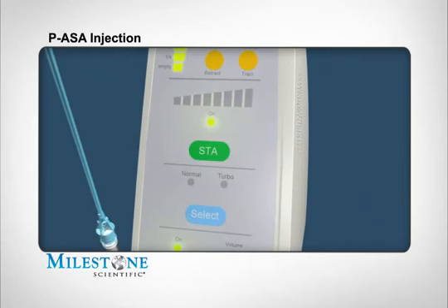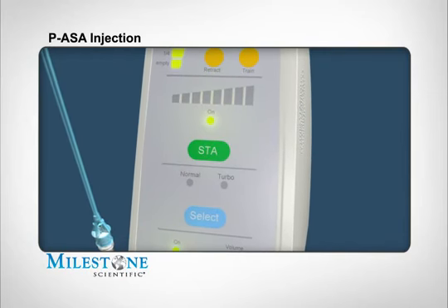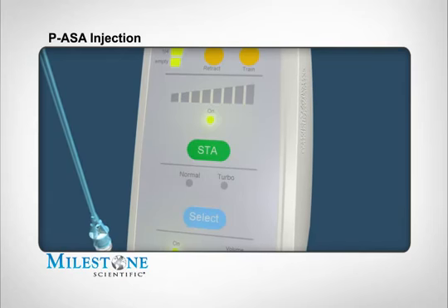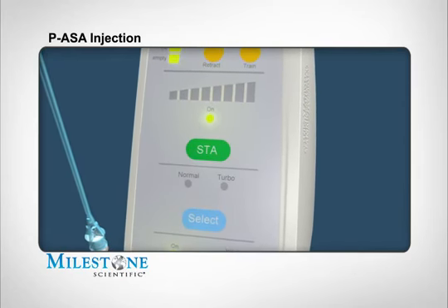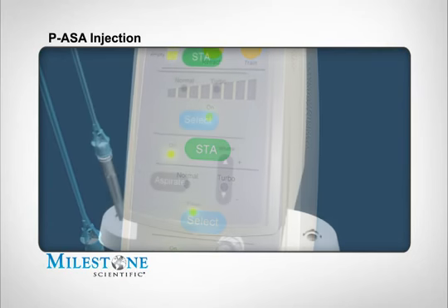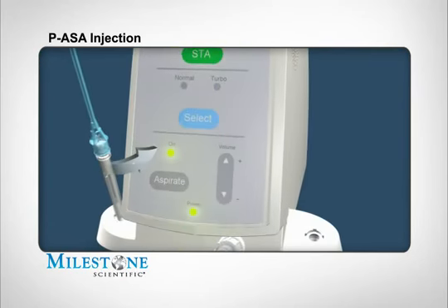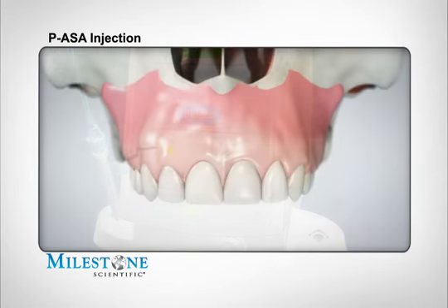Please note, it's critical to use the STA mode for this injection to ensure that a safe and controlled single flow rate is maintained throughout this injection. Delivering the anesthetic at a faster rate than the control flow rate can result in adverse tissue reactions and/or tissue damage. Make certain the aspiration feature is on, as an aspiration test may be performed during anesthetic delivery.